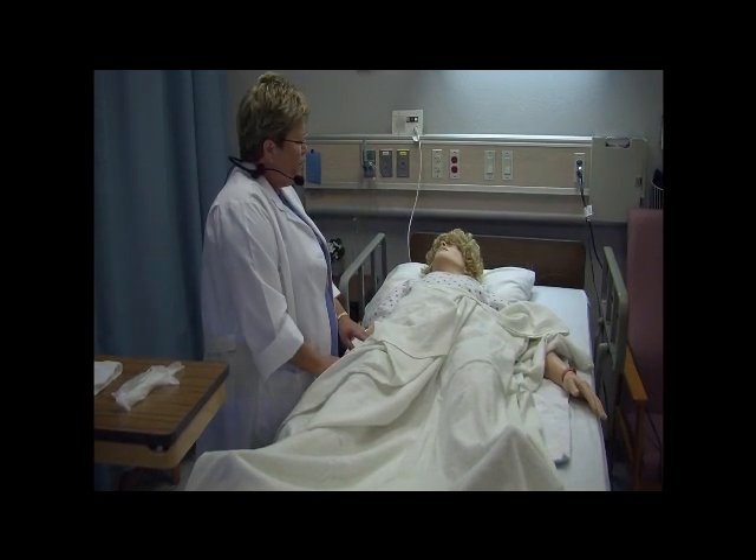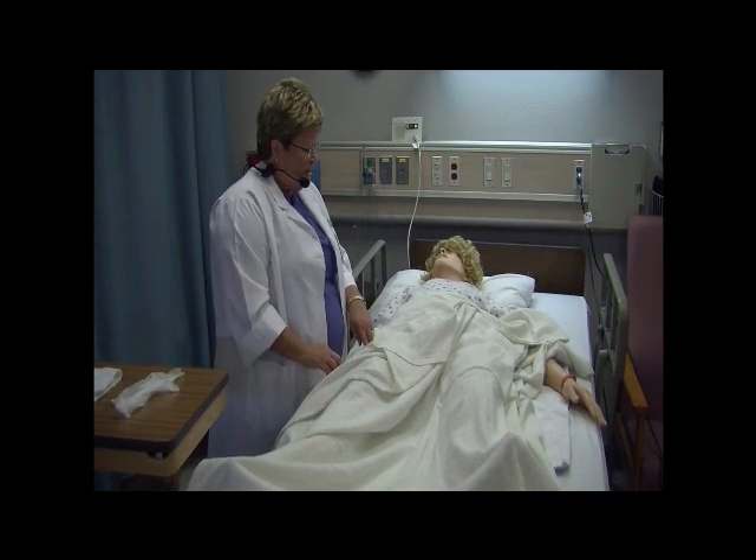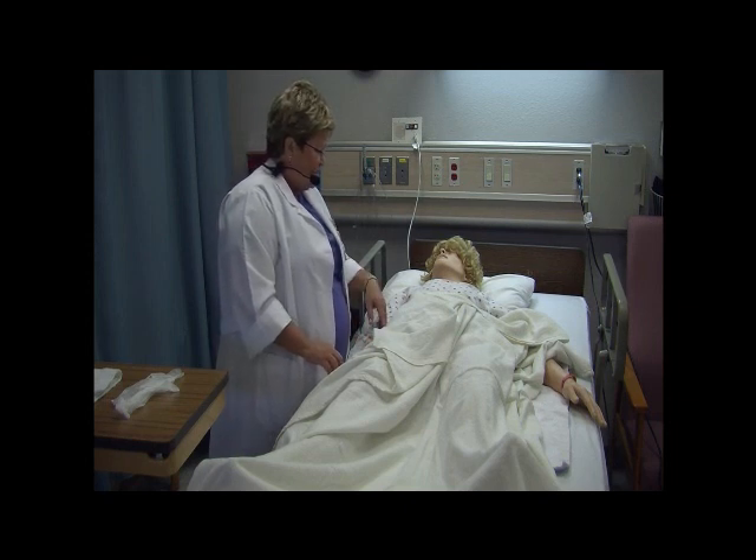Very good. He's ordered that we get a sterile urine specimen from the catheter that we just inserted. I'm going to go in and get started with that procedure. Before I get started, do you have any questions?